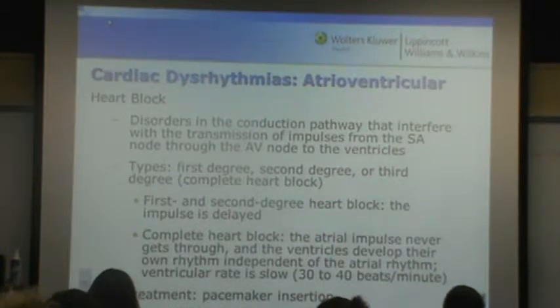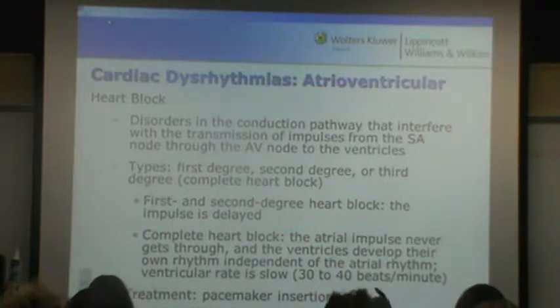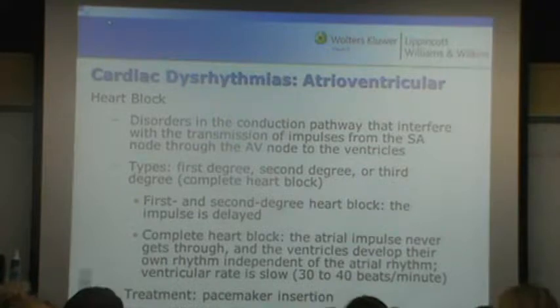All right. So my heart rate is 150, so it will be tachy. Okay, it's tachycardia. But what's the one thing that really jumps out at you about that particular one? Do you see any P waves? Or even better, do you determine a normal P wave before each and every beat?